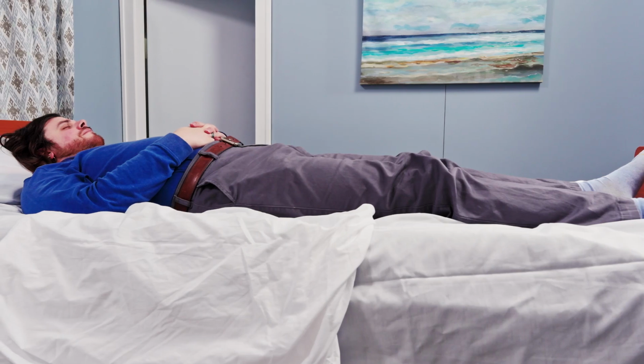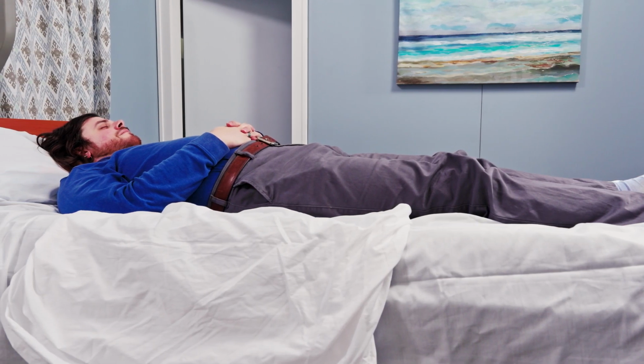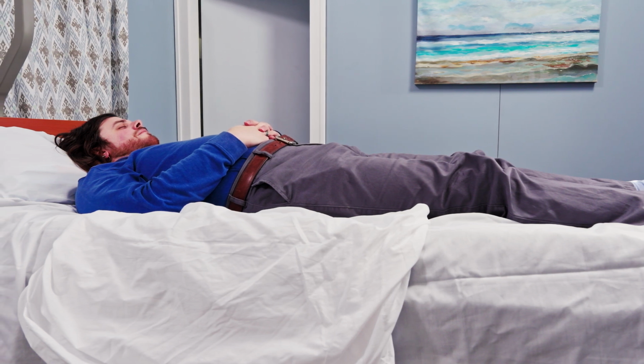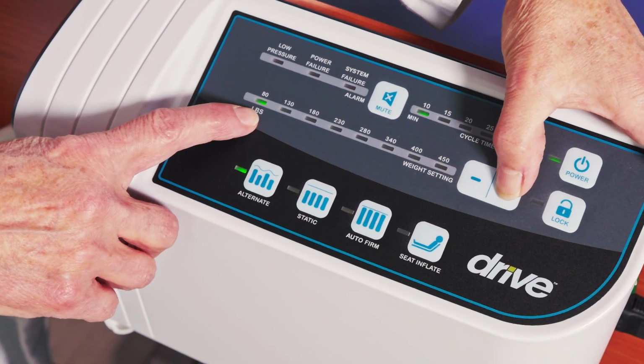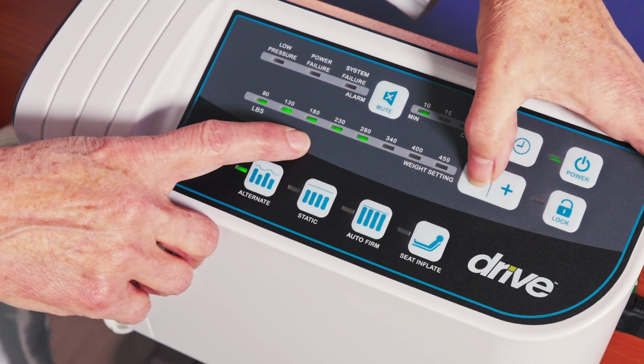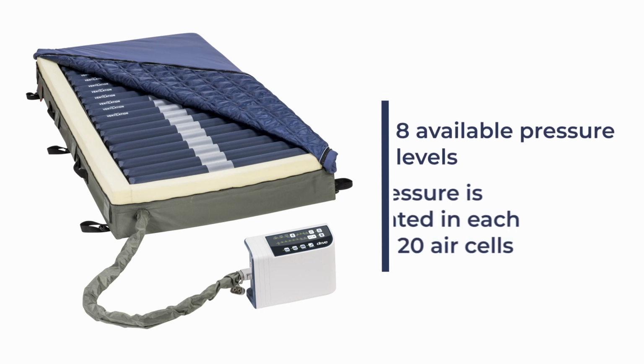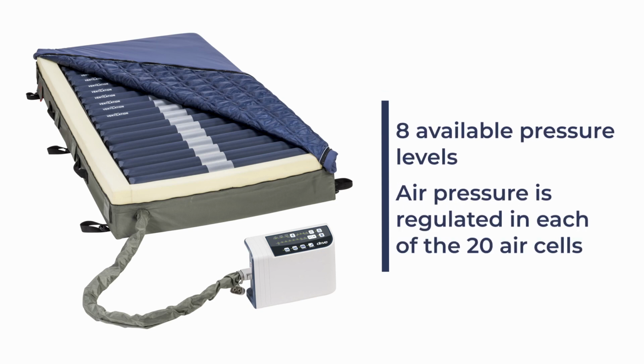And while the initial setting should be chosen based on resident or patient weight, comfort, and tolerance, it can be adjusted anytime. As the weight setting increases, the pressure level indicator lights up green with each added level of pressure. There are 8 available pressure levels, and the air pressure is regulated within each of these 20 air cells to ensure pressure redistribution and therapy are provided.